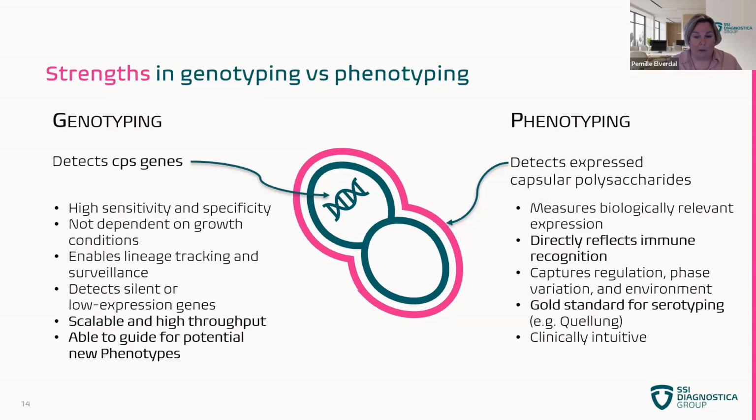It's highly scalable and high throughput, and it's able to guide us to look for new potential serotypes within the bacteria.